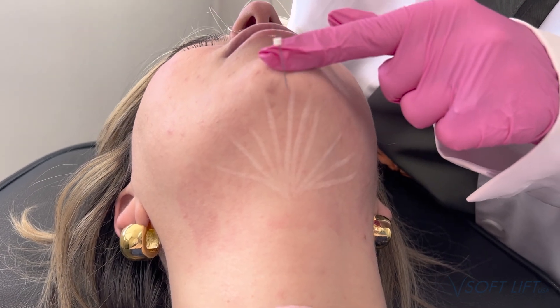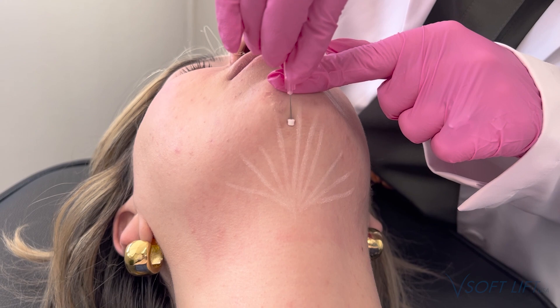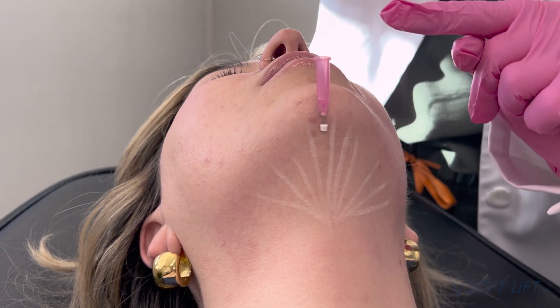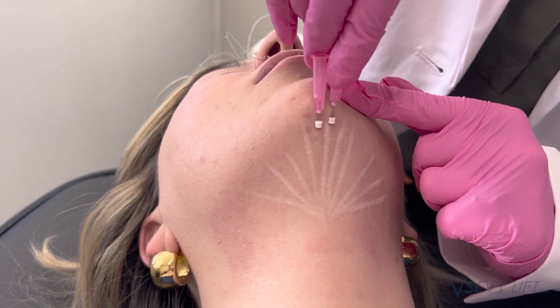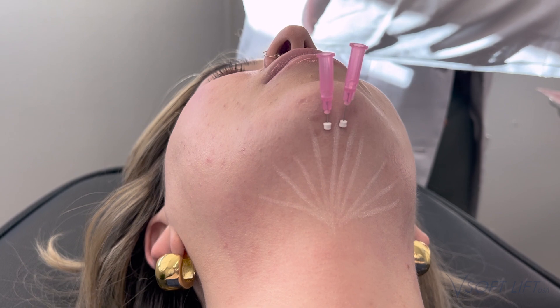In this video, we are treating a submental pocket with PDO twisted threads. These are VSOF lift threads, 29 gauge by 40 millimeter. Whenever I'm treating a submental area, I always reach for twisted threads. My goal is to stimulate as much collagen as possible, so I always reach for those twisted threads.